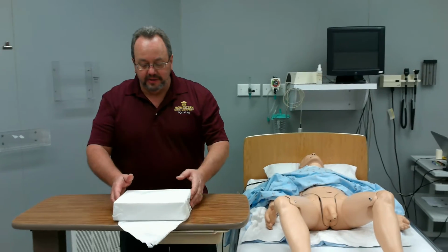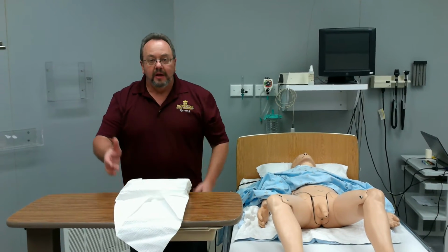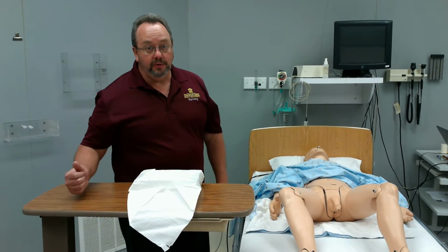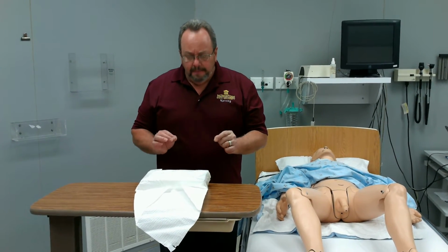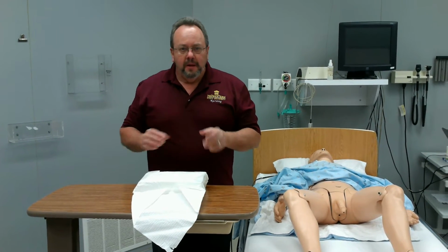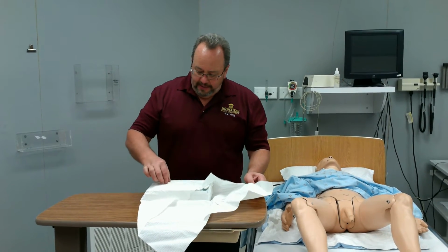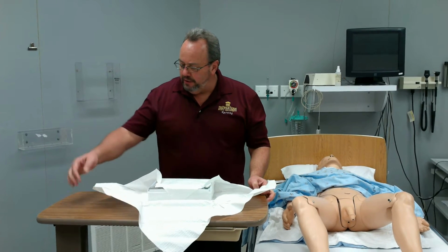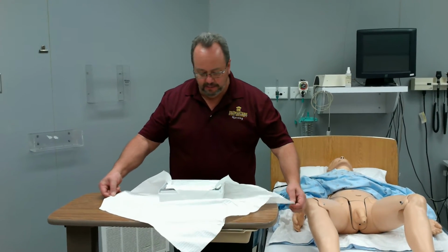This is actually designed that once you have opened that, you can just take this flap and open it that way and then turn it back towards you, and that's your first flap that has opened away from you. Then you're going to open up the side flaps, remembering that this is a sterile field and I do not want to contaminate my sterile field. Every sterile field has a 1-inch border that you can touch, but you can't touch beyond that 1-inch border. So I'm going to open this by pinching this open and pinching this side open, then using that 1-inch border to straighten and flatten it to make sure it doesn't flip back into my sterile field.